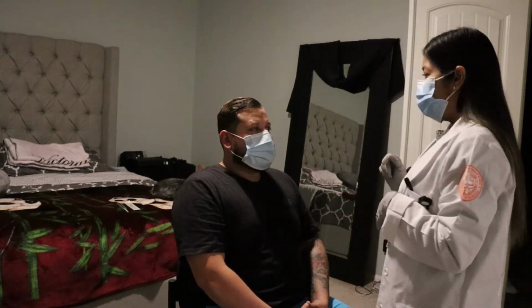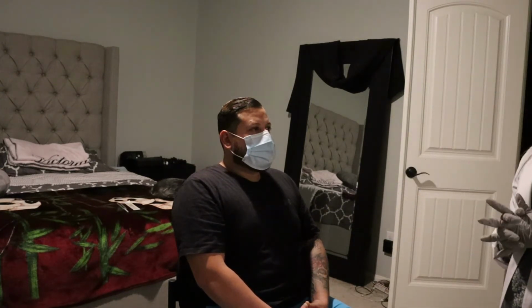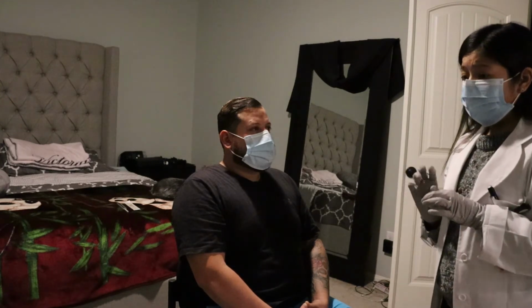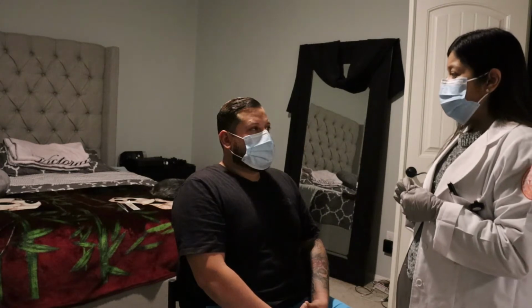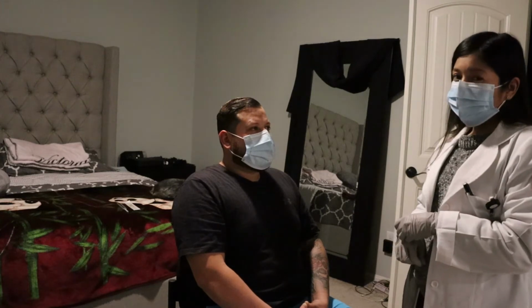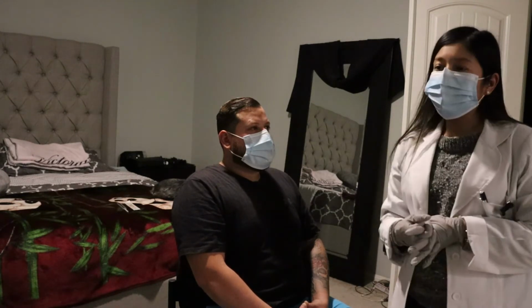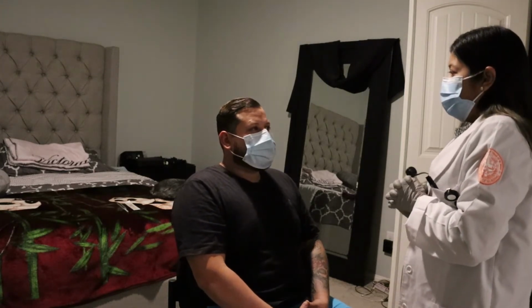And then I would shine the light in his pupil, and I would look for the red reflex, which indicates that I'm looking at the retina. And then I would adjust and focus the ophthalmoscope by using the diopter, and I would look for the optic disc, which is a round structure. It's red, orange and yellow in color. And then I would look at the retina and assess the veins and the arteries.